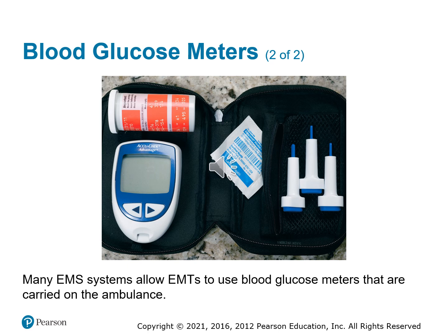There's also, it shows a picture here of an alcohol prep. It's very important to clean the area first. You don't want to introduce any bacteria into the body, and vice versa. You don't want that blood coming out contaminated. That might skew what your reading is.